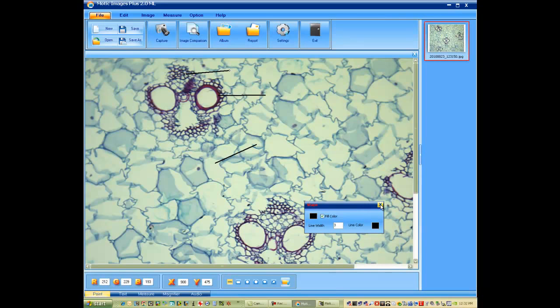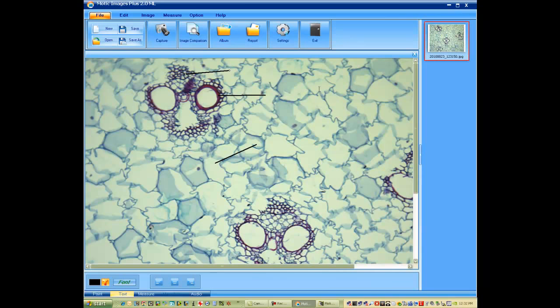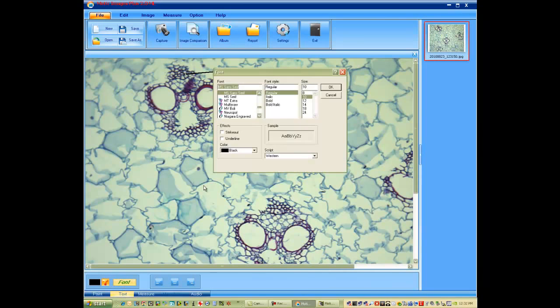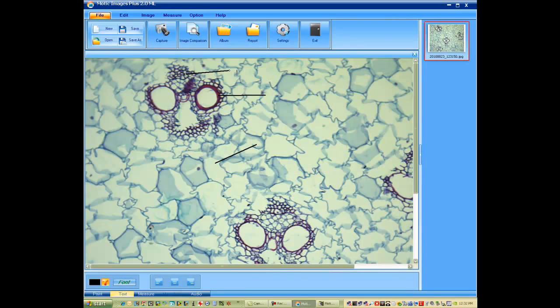Now we'd like to add text to those. Down to the bottom left hand corner is the text tool. Simply click on the T for text. And when you click on the image, it'll open up a text tool. You can change the font. In this case, let's make it bold and a little bit bigger. And you can also change the color. It's pretty much standard for any word type document.